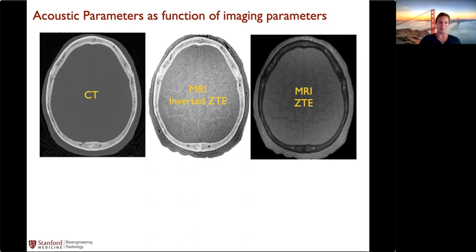Yeah, I'll harp on the point really quick. If you're trying to make a product or a usable thing, you really don't want to pay for both a CT and an MRI. There's time and huge amounts of cost associated with that. And Kim mentioned this, but with an MRI, you're getting a really detailed image of the brain, and these days the tools to map the regions of the brain are very quick and very easy. And a CT gives you none of this. So what Kim's work is trying to do, relating CT and MRI, or Hounsfield units, is really important.